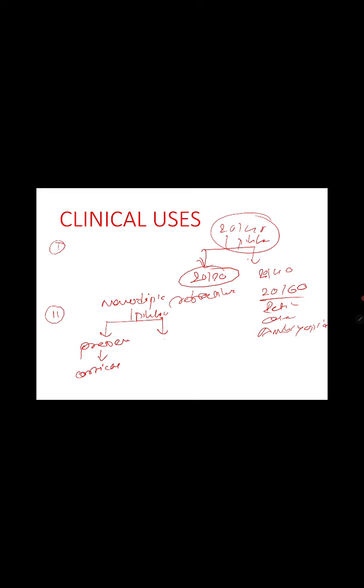If we put a pinhole in case of monocular diplopia, and the diplopia goes away, or is negative, then it is a kind of ophthalmic, not cortical, cause, just the ophthalmic eyeball. Either it is a retinal membrane, or subluxation of the lens, or corneal opacity, and all these things. So this is the second use, which a lot of students don't know, that this is the use of pinhole.